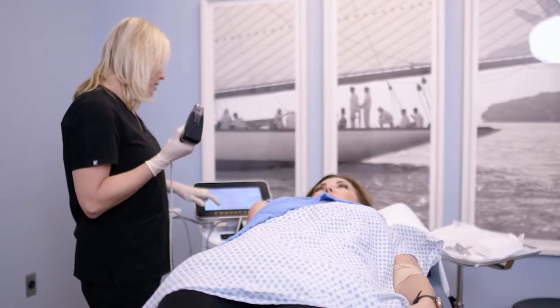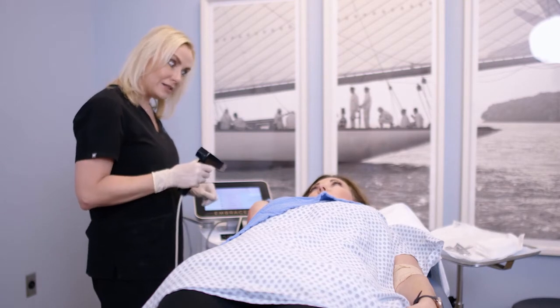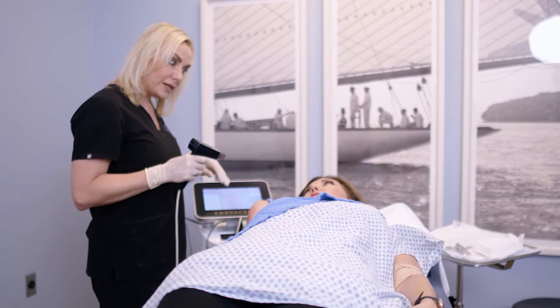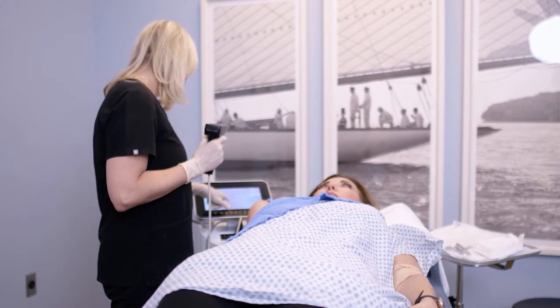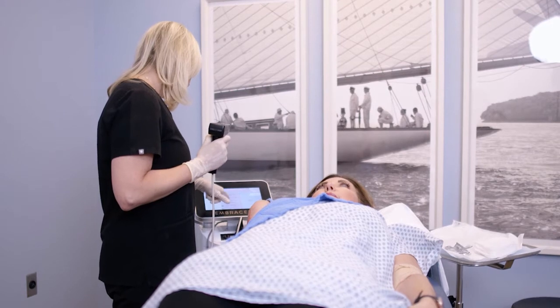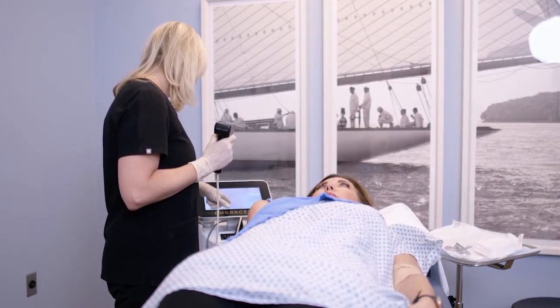To start, we're going to go at a depth of 4 millimeters because that's going to hit that fat tissue again. It's going to go really down deep. It'll actually send the energy all the way down to 5 millimeters. The prong itself is 4 millimeters, okay? And we're going to go to a really good energy of 50. Cycle.